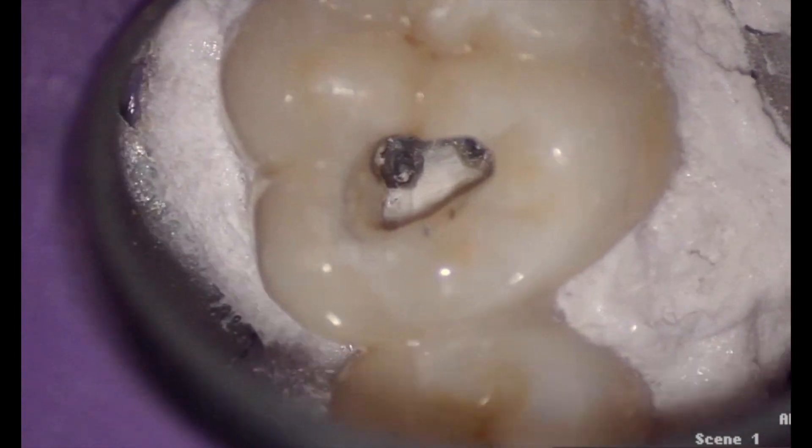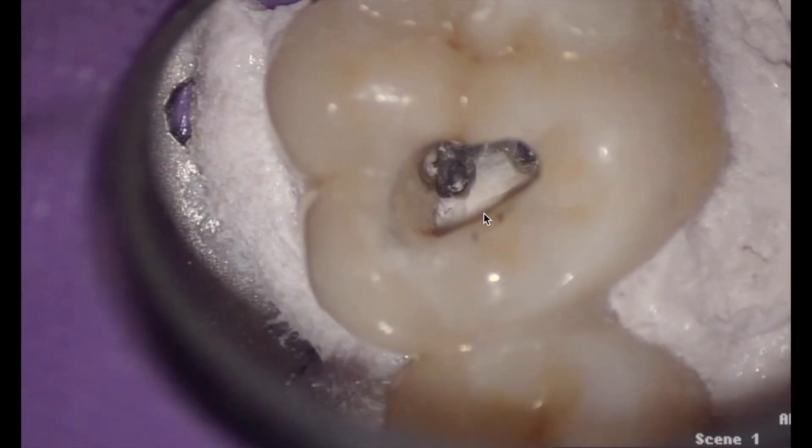Normally I remove all of this, but I was fairly confident that was MB2 and not an MB3, so I elected to keep it. I'm using nice light brushing strokes with a really small round burr — usually I use the purple one. As I'm literally brushing a little bit apically, here's the orifice. I brushed it mesially — now you've got kind of like two eyes and a nose. There's the orifice right there, and there's the MB1 orifice. I went a little bit too much mesially — I'm not proud of that — but that's what happened.